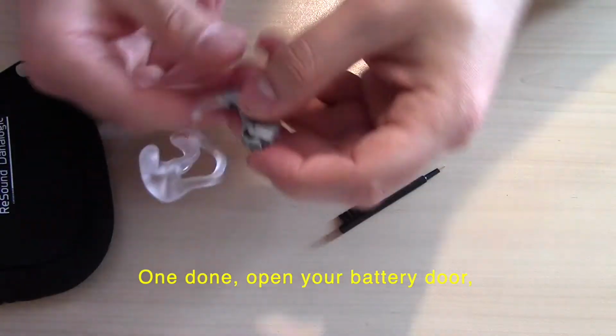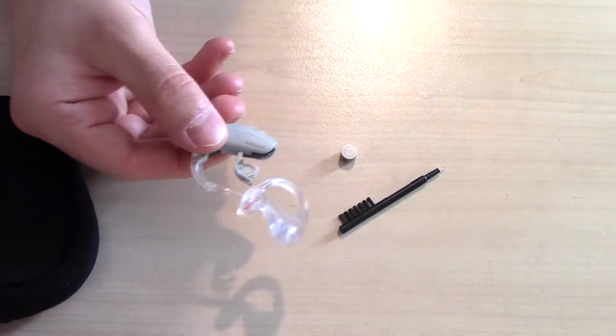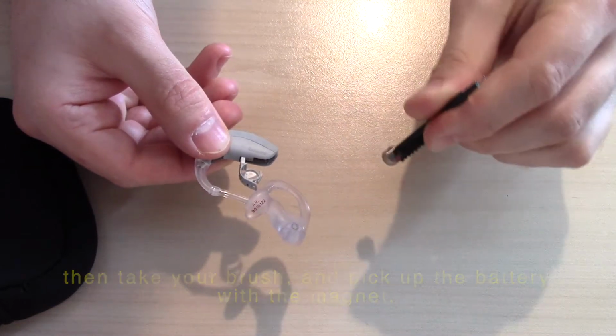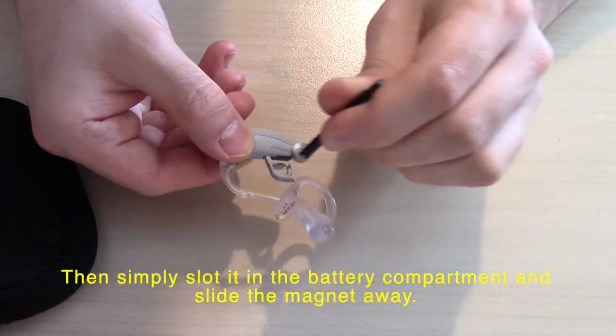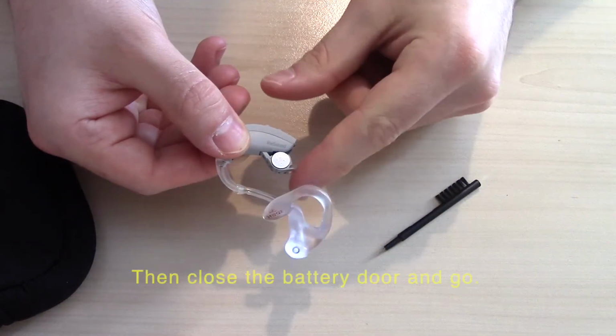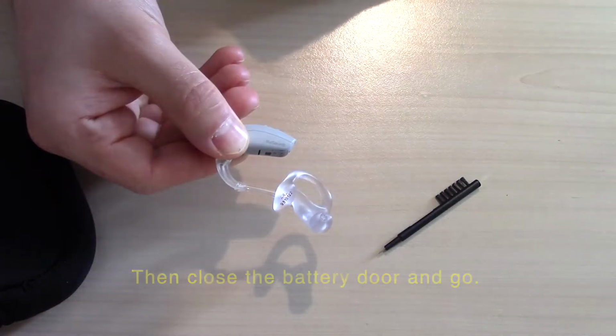Once done, open your battery door, then take your brush and pick up the battery with the magnet. Then simply slot it in the battery compartment and slide the magnet away. Then close the battery door and go.